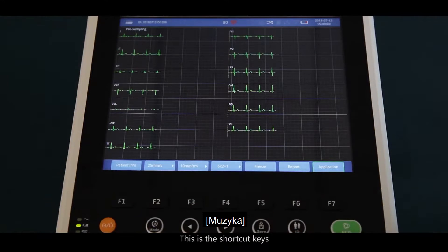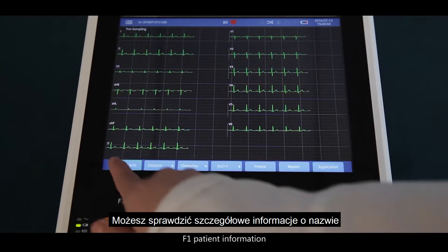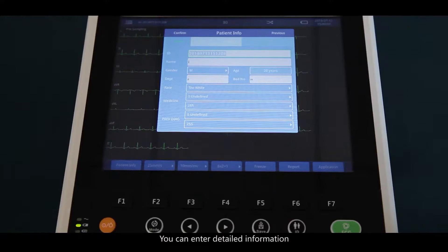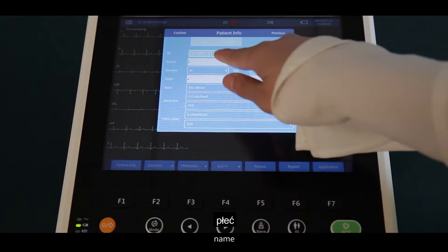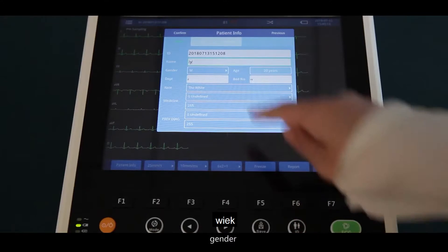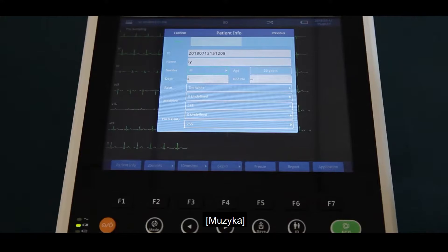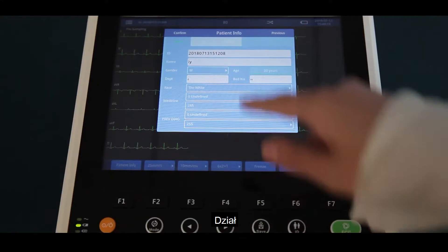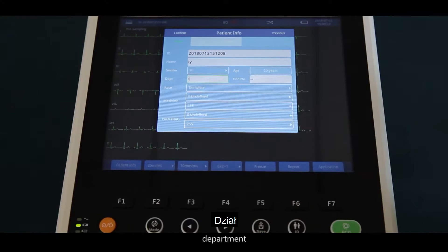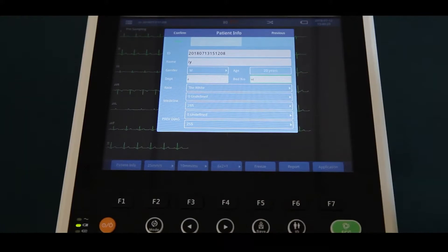These are the shortcut keys. F1 is patient information — you can enter detailed information including name, gender, age, department, bed number, and race.